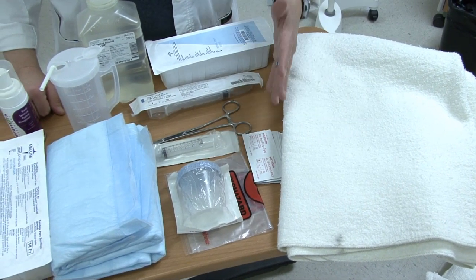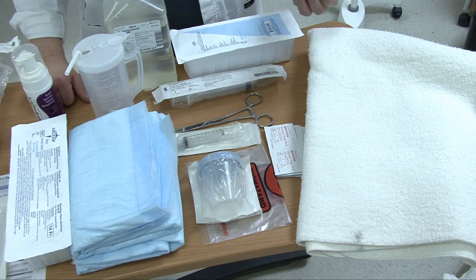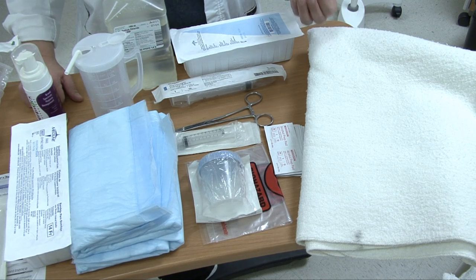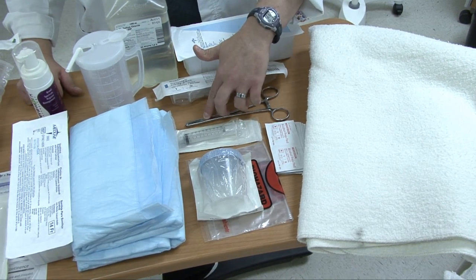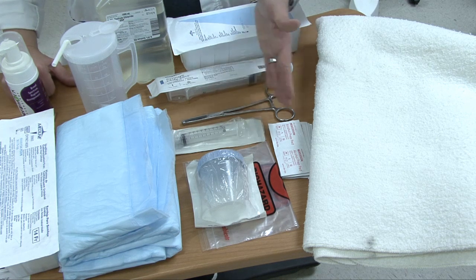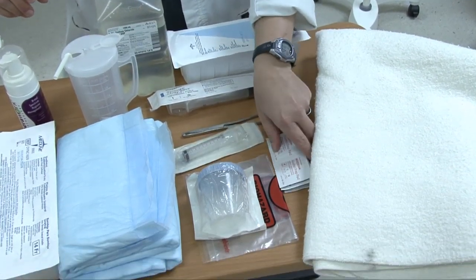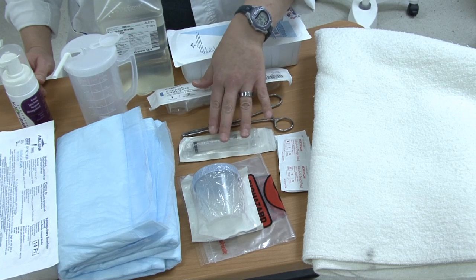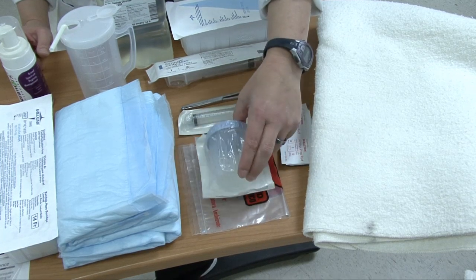For obtaining a specimen, if you're going to use a simple in-and-out catheter it would drain directly into the receptacle. But if the catheter is already in place, evidence-based practice states it's best to obtain the specimen from the port on the catheter. To do that, you would need hemostats without teeth to clamp off the tube so urine can build up, a needleless syringe — usually 10 or 20 cc — to connect to the port, alcohol or whatever your agency policy says to clean the port, a sterile specimen cup, and a biohazard bag to transport the specimen.